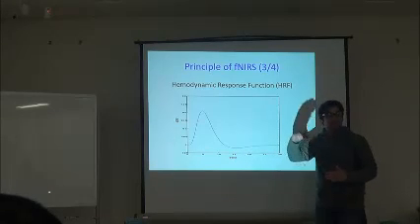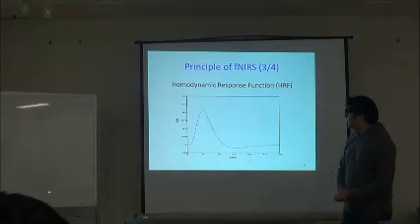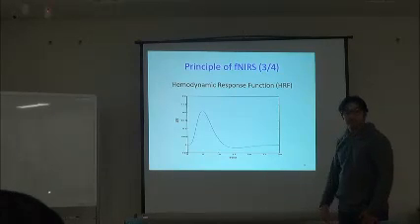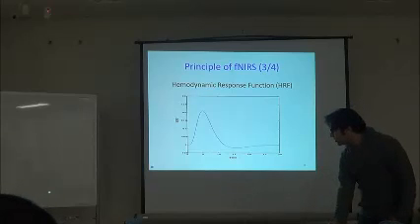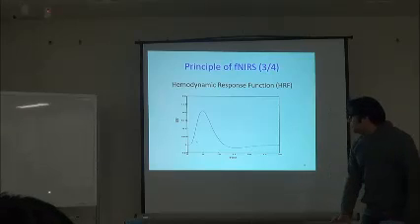For that, we need the whole signal, and that whole signal comes to us after 5 to 7 seconds of the activation, and that's a huge delay which should be reduced somehow. It cannot be reduced because that's an inbuilt process, but somehow if we can detect the initial bit, we can do more advanced research.